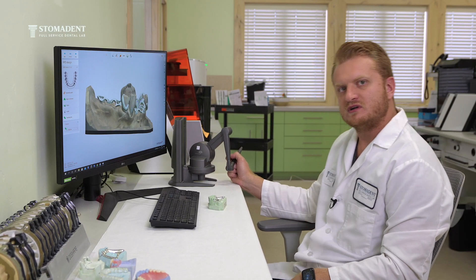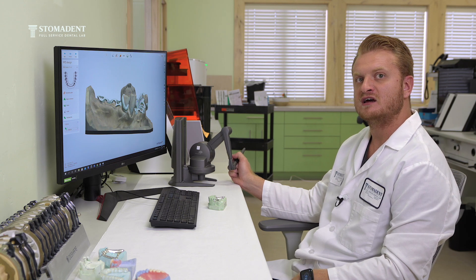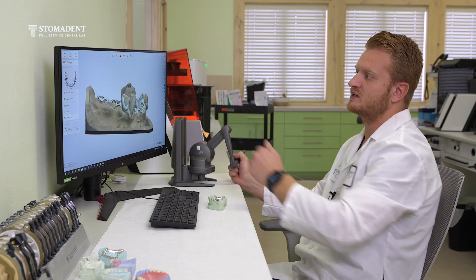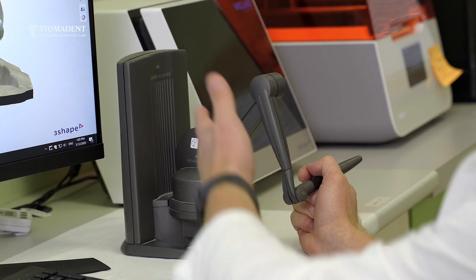One thing our laboratory does that's a step further than another lab is the fact that as we digitally design our frameworks, we are also able to use this haptic device.